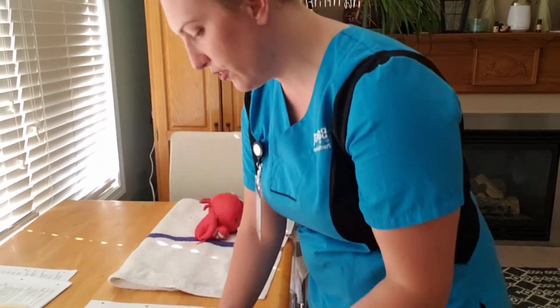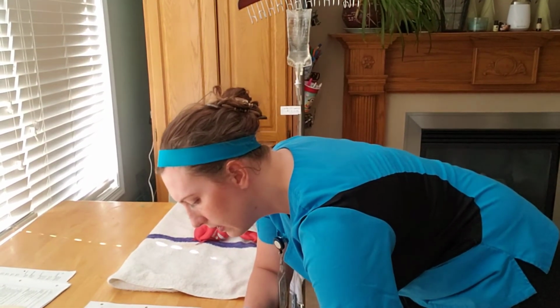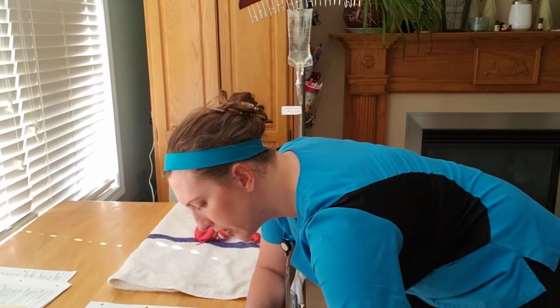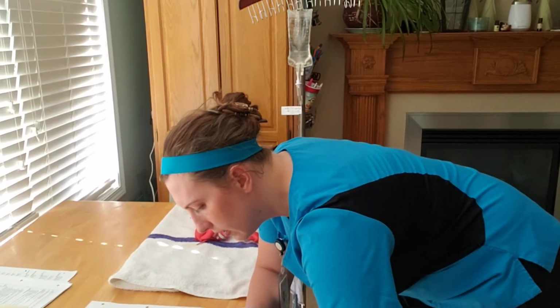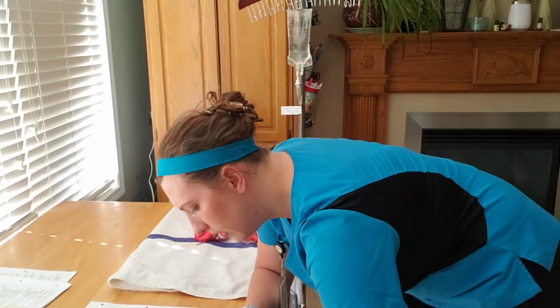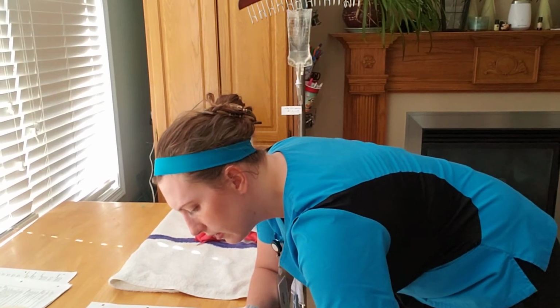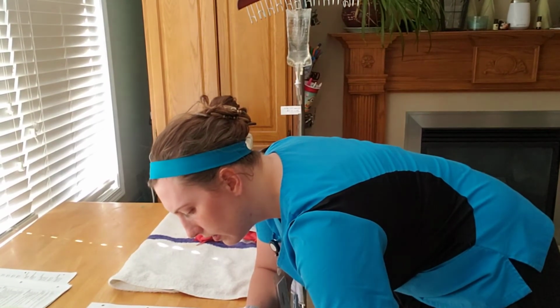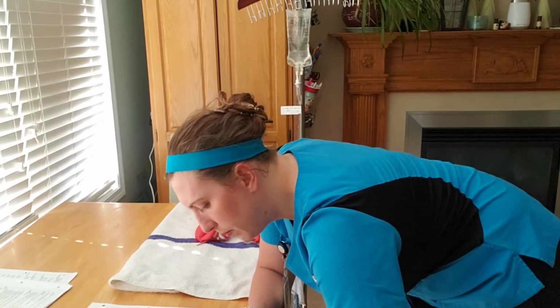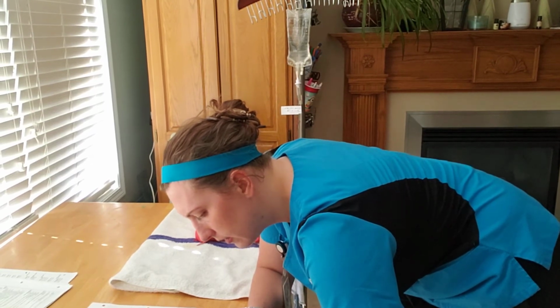I'm going to label that straight away. This is ranitidine. That's the medication at 50 milligrams. In 0.9% sodium chloride, NaCl. Patient's name is Chinook, Allison.